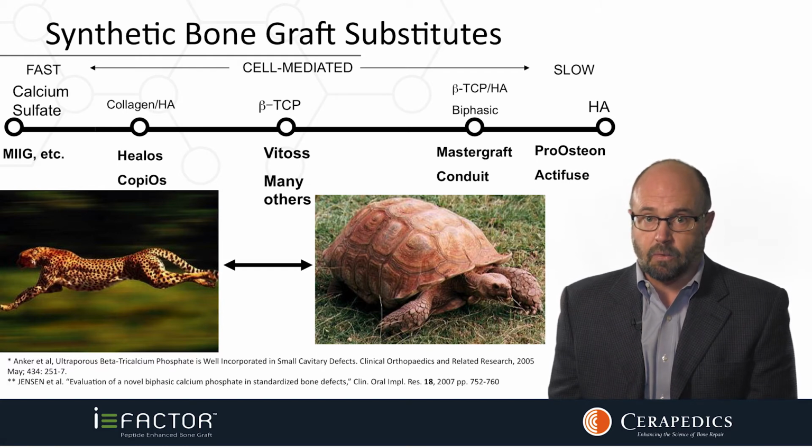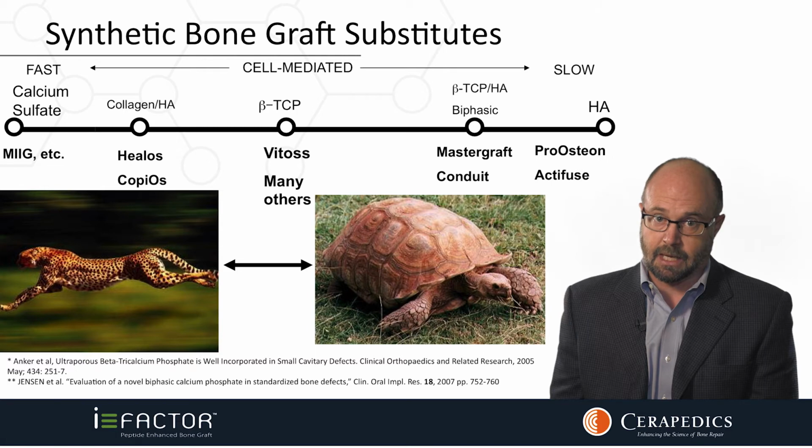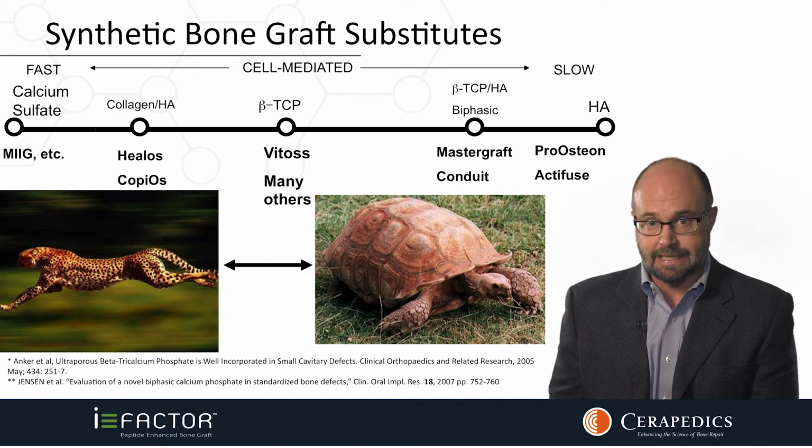If we now jump all the way to the right end of the spectrum, we will find materials such as synthetically derived, synthetic crystalline hydroxyapatite. Now, while the normal bone mineral is in fact crystalline hydroxyapatite, it is of an enormously different scale, being on the order of nanometer scale crystals. It also has chemical defects in it such that it can in fact be resorbed, but synthetic crystalline HA is effectively non-resorbable in any clinically relevant time frame. A number of companies have prepared composites of hydroxyapatite and other calcium phosphates such as TCP. These may resorb faster than HA, but in practice, these are largely non-resorbable as well.